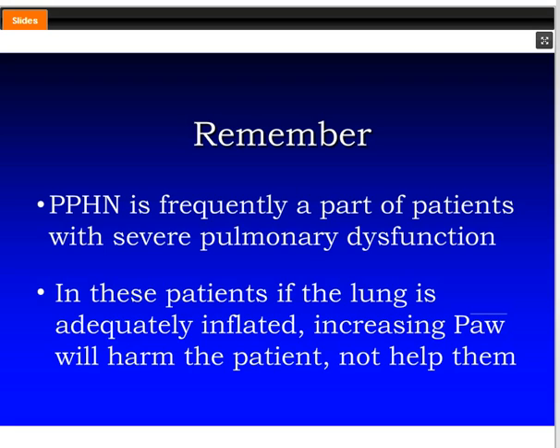If the saturation, let's say the saturation has been running 92, 94, you suction the baby and the sat is now 88. If over the next 10 or 15 seconds it starts to come back up, you don't have to worry about it. If it doesn't, then the goal would be to turn the mean airway pressure up by 1 to 2.